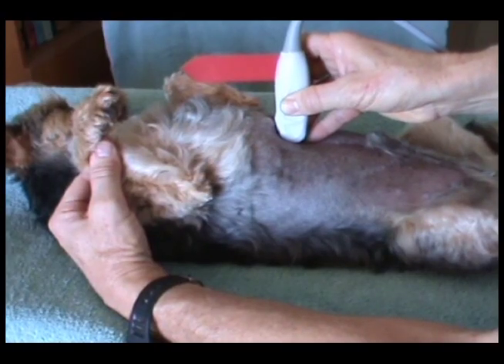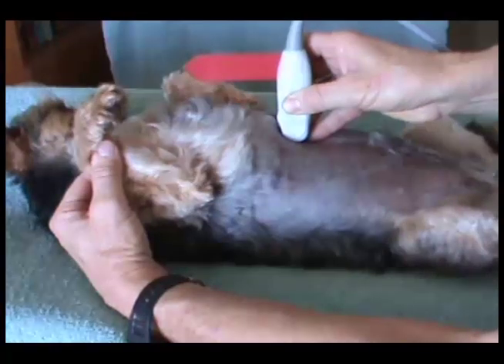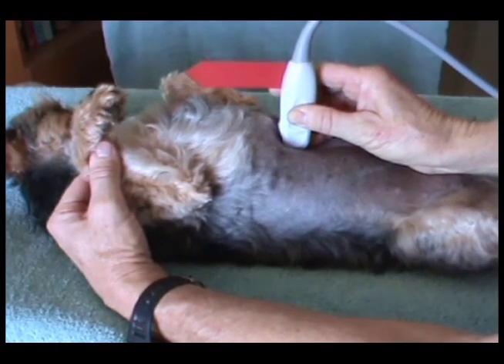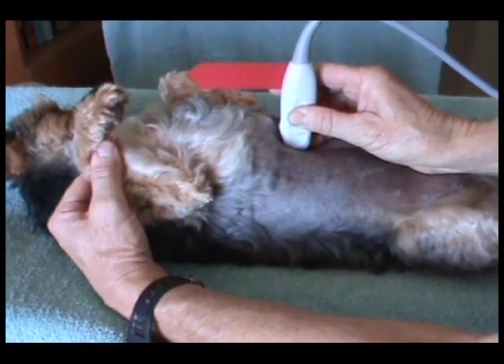When you press the freeze button, practice leaving your transducer hand relaxed and in position so that when you unfreeze, you will still have the same image. This will save you time and effort.